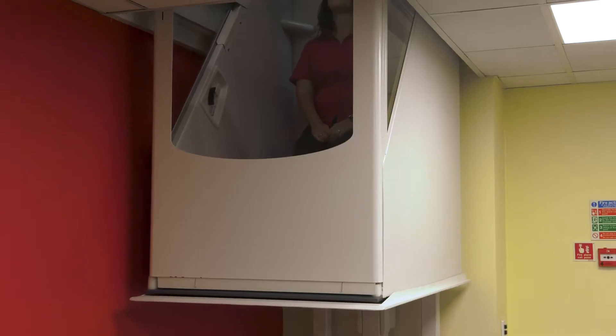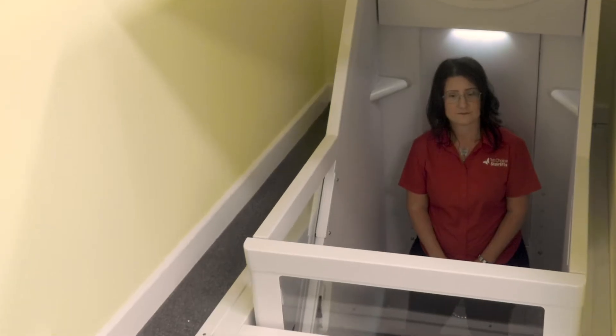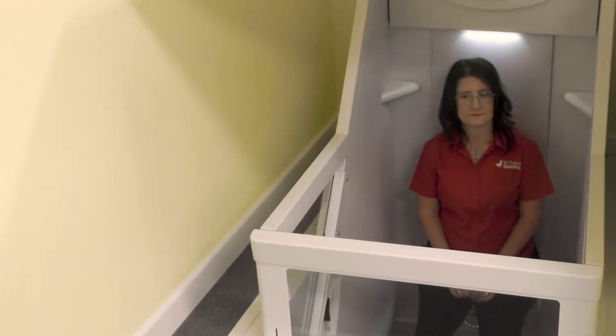If you have problems using the stairs but a stair lift isn't suitable, then we offer a range of vertical home lifts, or through the floor lifts as they are also known. So which home lift model would be best for you? Let us show you all the features the Wessex home lift range has to offer.